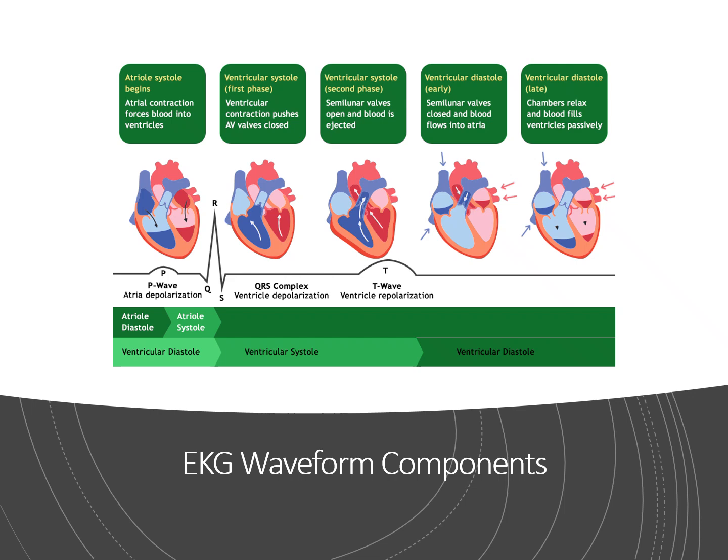This is actually pretty cool in critical settings because if you have newer residents or if you are getting an EKG on a patient and you see these T wave changes, then that can signal to you to alert the doctor and maybe catch a STEMI before it even happens.